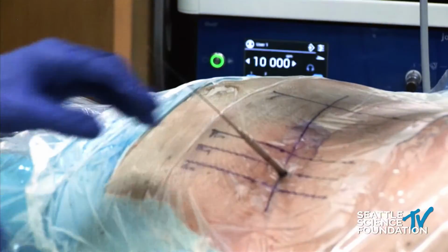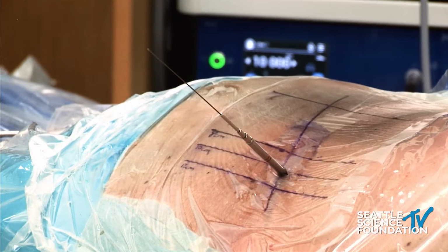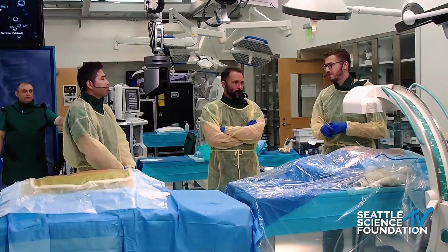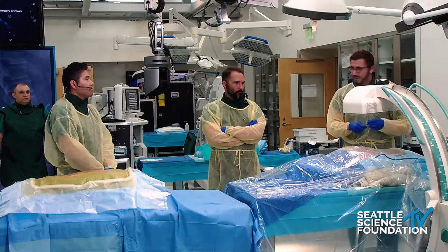And Osama, do you ever just skip the reaming and just go straight to the scope? That's a great question. A lot of people do that. There is a 1 in 3 dilator that you could put in there. So this is this here. If you have a large foramen like this, honestly, you could probably just use this. Just do a 1 and 3, and then put your working channel in there, and then use the drill more than using the reaming. But reaming is way faster, especially in a foramen that's tight. So the example that Christoph had earlier at 5'1", I mean, it would take forever to drill bone there. So I think reaming makes it a lot easier, in my opinion. I don't know what your thoughts are about that.